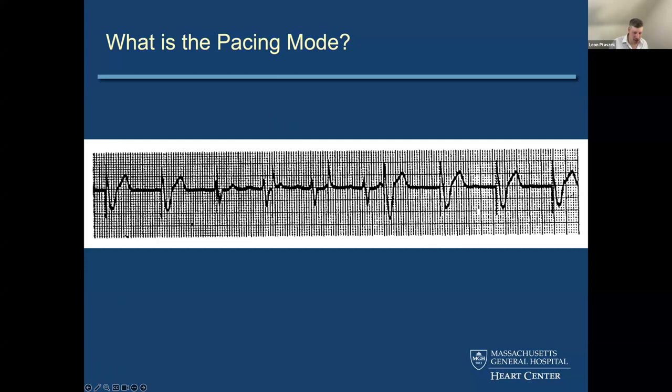So anyway, you've got this non-physiologic spike followed by what appears to be a QRS complex. Then you see this hairline trace that's in time with the interval between these non-physiologic spikes from before, but you see a different QRS complex, and you see that the QRS complex starts a little bit just before the pacing spike comes in. Here, the next thing you see is a native looking QRS complex followed by a pacing spike. And then you see another native complex coming in before the next pacing spike. And as you see here, the RR interval between these native complexes is consistent, and there's no change in the timing of this non-physiologic spike, which is, as you all have guessed by now, the pacing spike. And you see the QRS complex coming in.